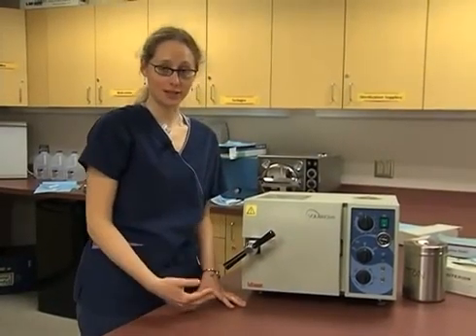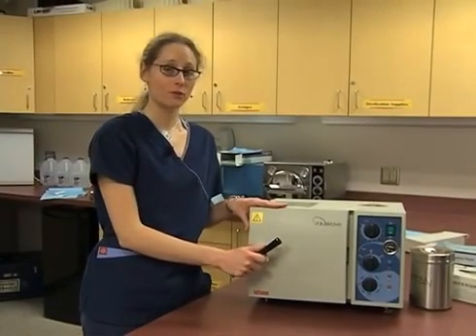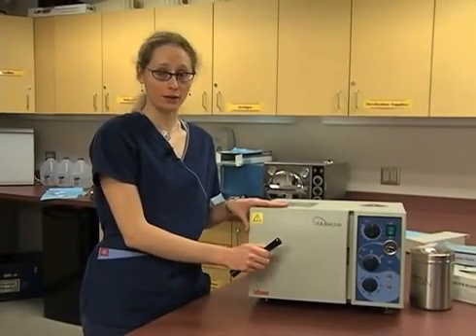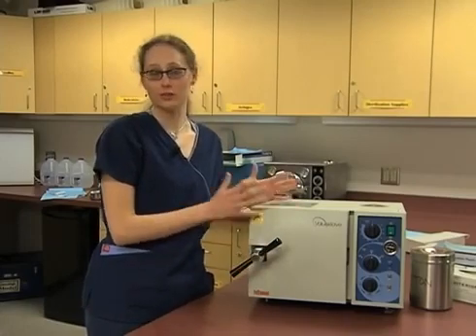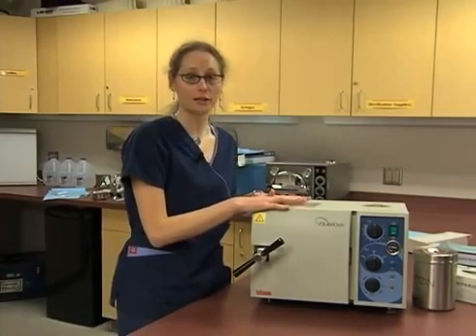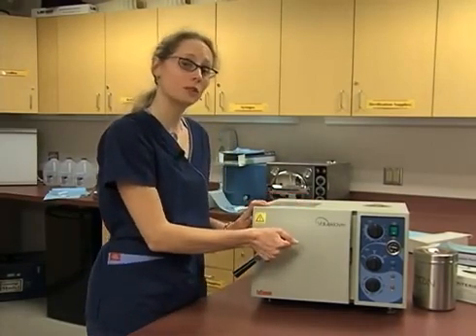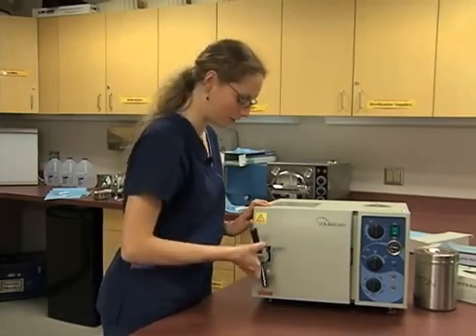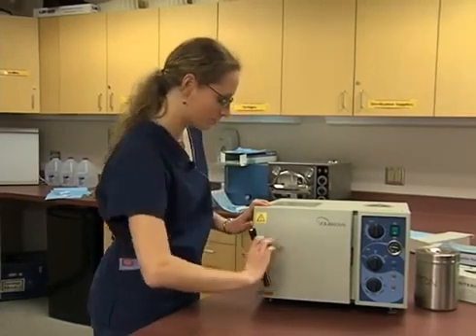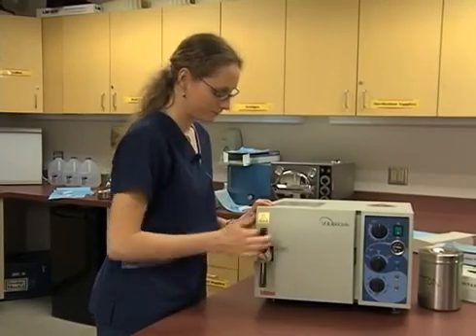When the autoclave is done, and after it's depressurized fully, then we can open up the autoclave. Each autoclave will have its own system for how it allows you to know that the autoclave is ready and done to be opened. All the items should be dry when we pull them out. So we will undo the door.